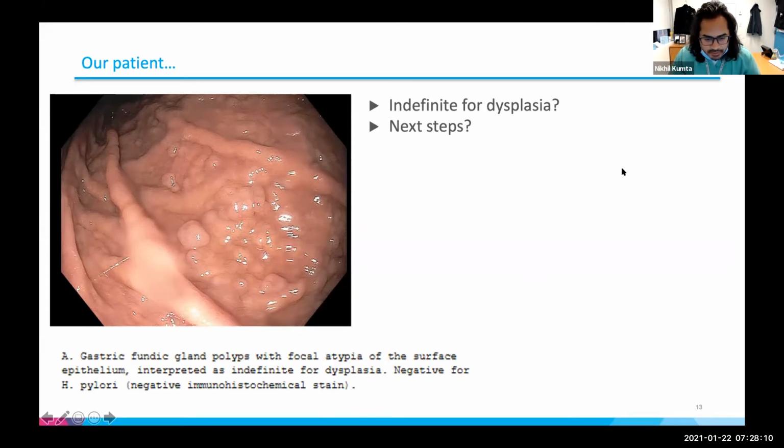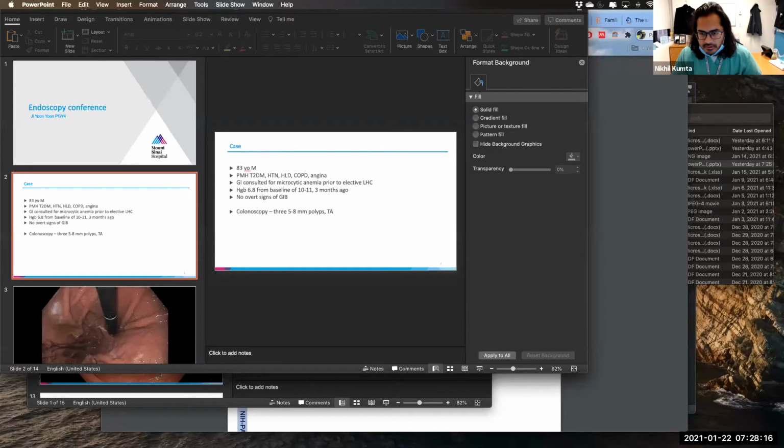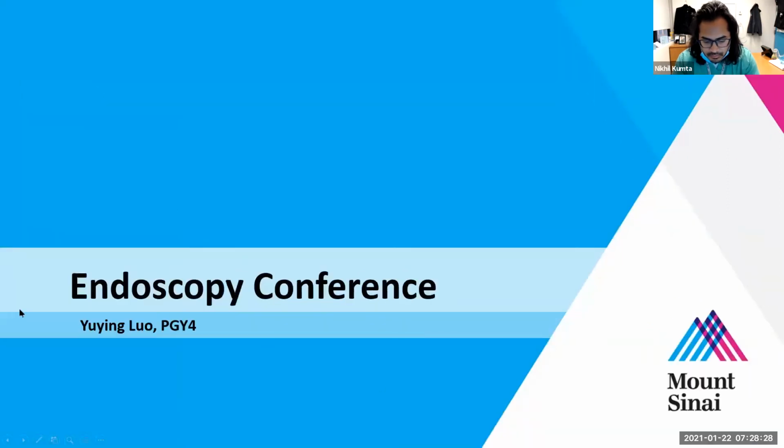Great. So let's move on to our next case, who I think is going to be Yu Yang presenting. Hopefully you guys can see my slides. This is a case that I scoped on consults with Dr. Mazur a couple months ago.